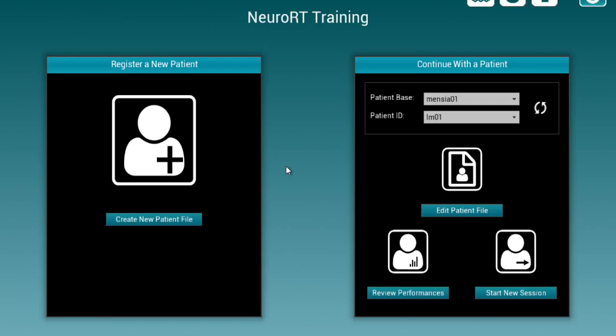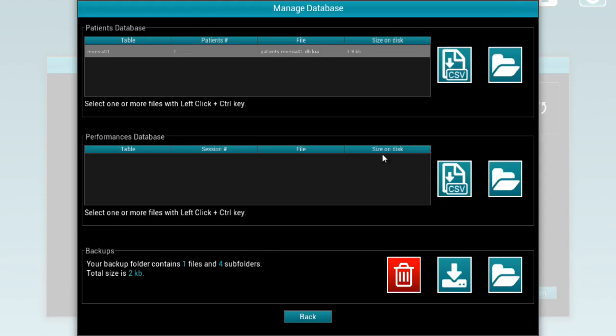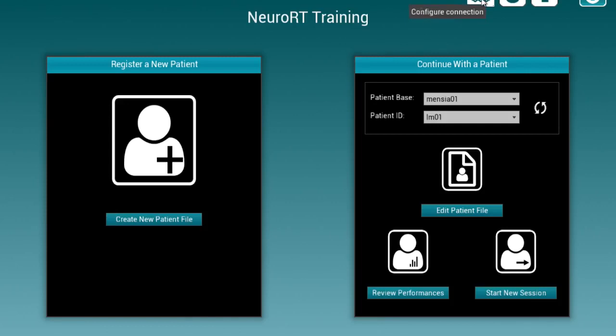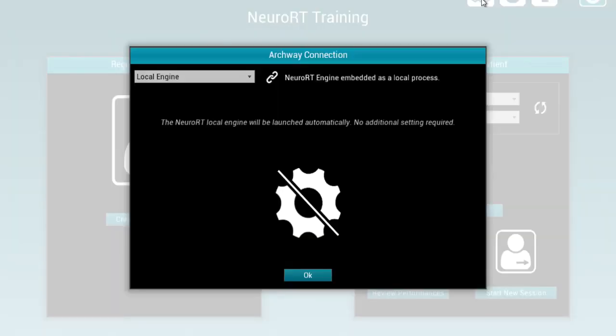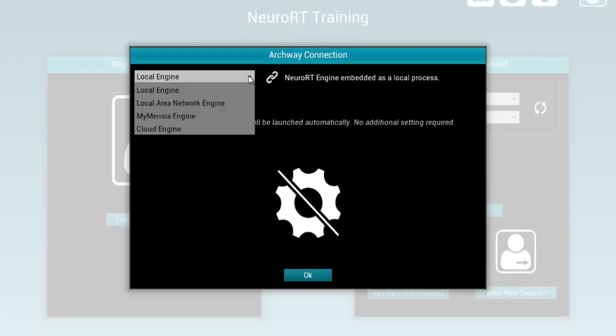First off, we'll have to select a patient. This patient can be either created if it's a new patient or selected from an existing database. You can select from different database files created previously and decide to run your processing either locally or remotely on different server processing locations.